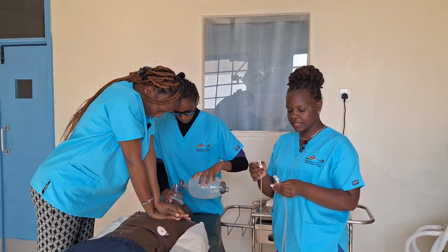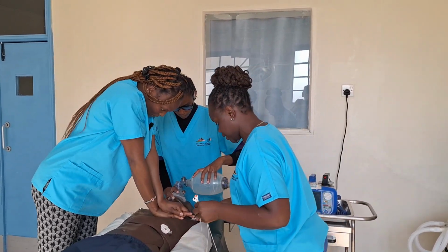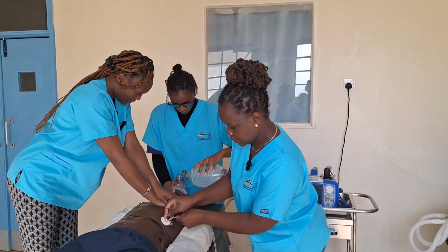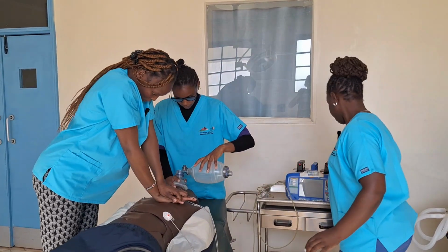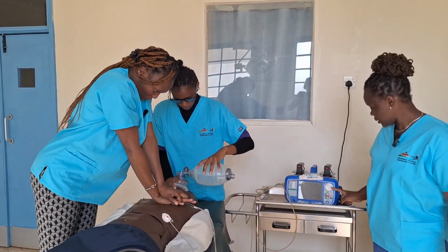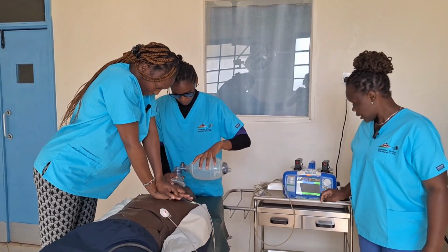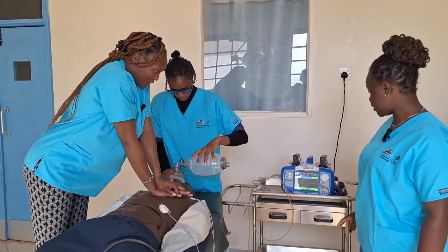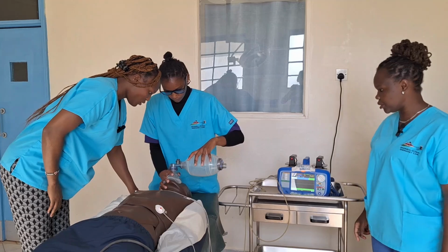I'm going to connect the monitor to the patient, so I'm putting on the leads. My machine is on. At this time I'll ask Jackie to stop for a pulse check as I check for the rhythm on the monitor.